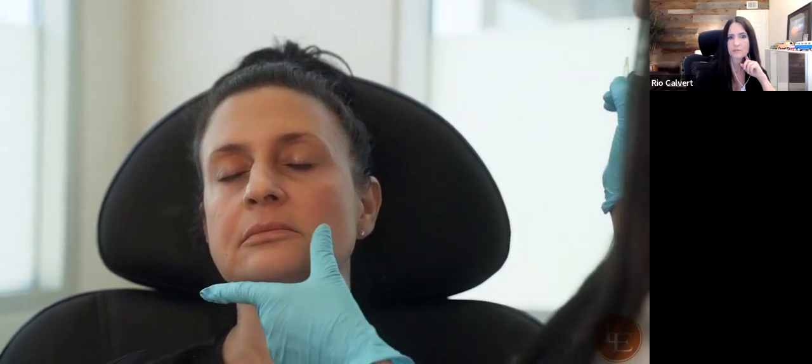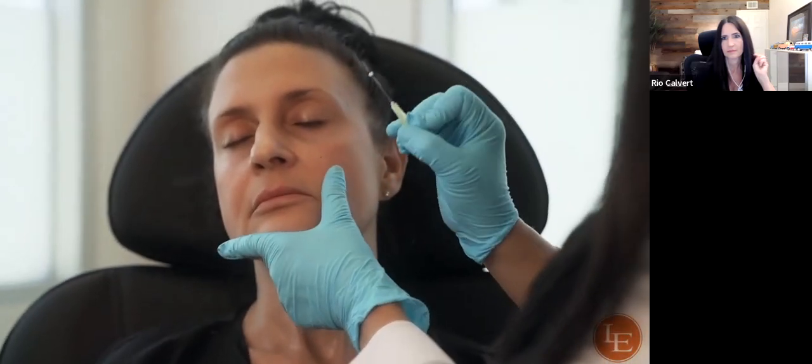Using a 29-gauge 38mm smooth thread on a blunt tip cannula: made a port with a 21-gauge needle, numbed with 1% lido and epi. Insert as many threads as needed through one little port. Stay subdermal — just below the dermis — to promote neocollagenesis, creating collagen and elastin, thickening and tightening the skin. Pull the skin taut, insert very easily. Press down, turn 360 degrees to help get the thread off the cannula. Quick and essentially painless.